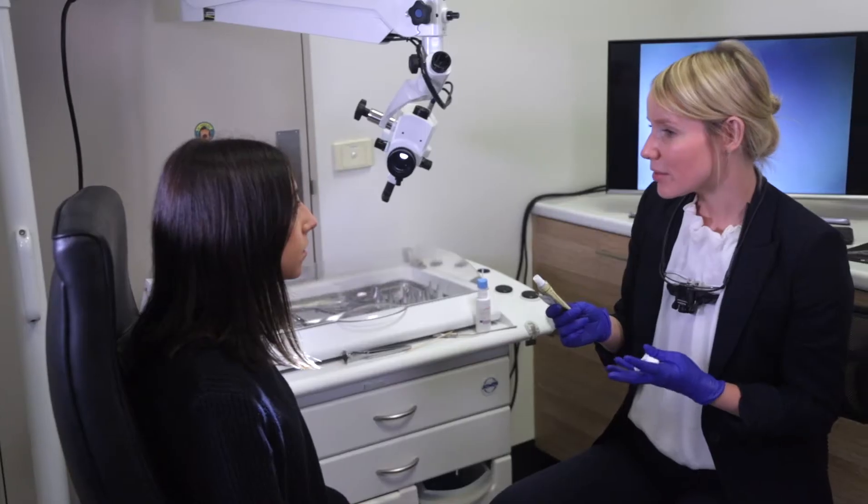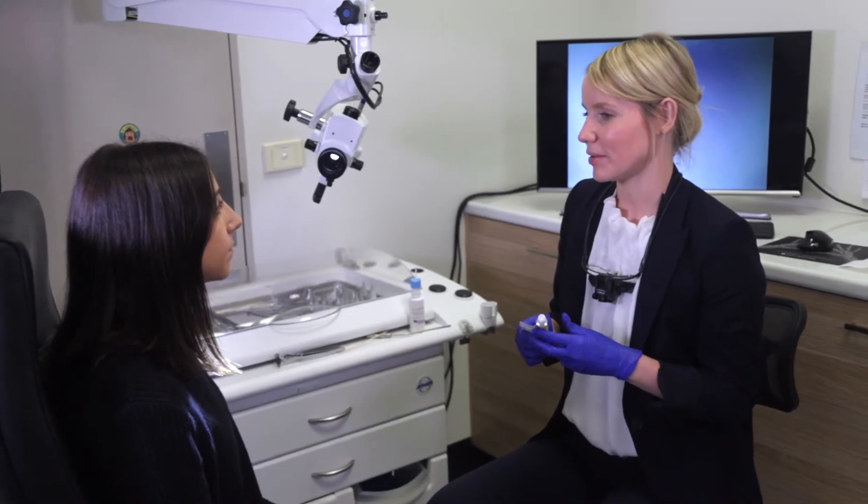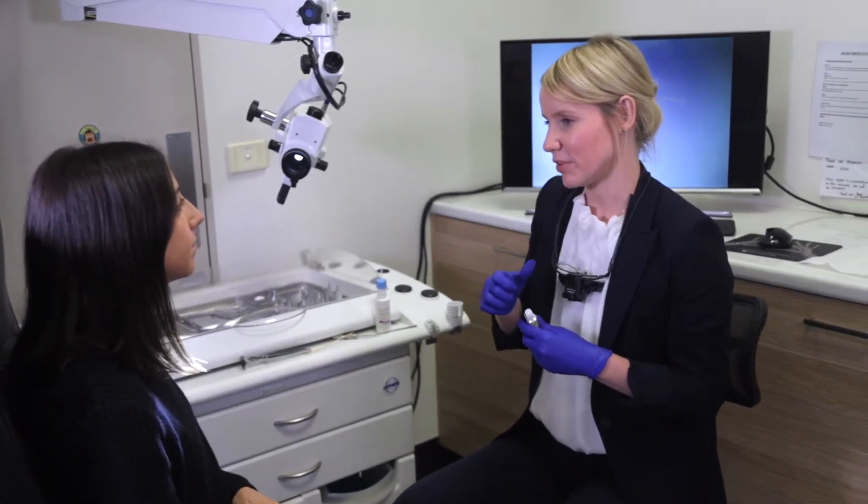This spray has a slight bitter taste, but at MEG we have a range of custom flavoured anaesthetics to minimise the unpleasant taste. As the numbing sets in, you'll feel like your throat is swollen or thick and you'll find it a little bit hard to swallow. This is just a trick of sensation — your throat is completely normal, but a numbed throat finds it hard to initiate a swallow. This will last for 20 to 30 minutes and we advise you not to consume any hot food or drink until your sensation has returned to normal, just so you don't burn yourself or have food go down the wrong way.